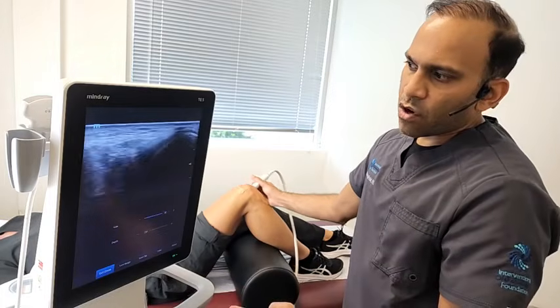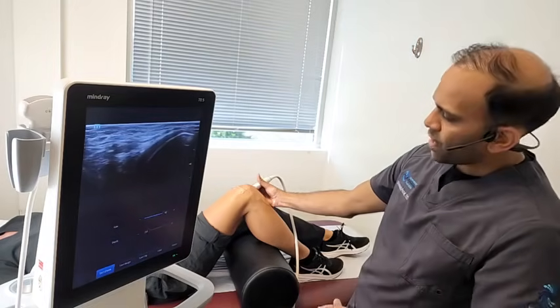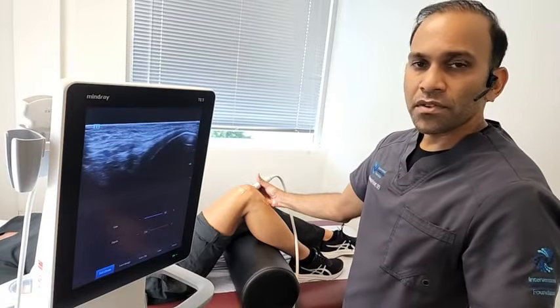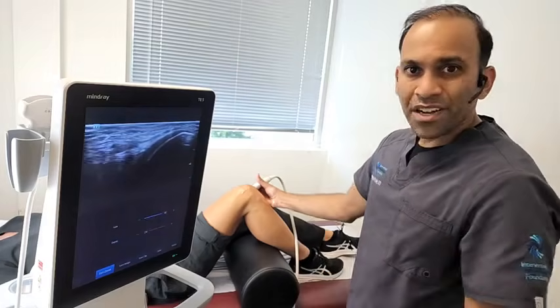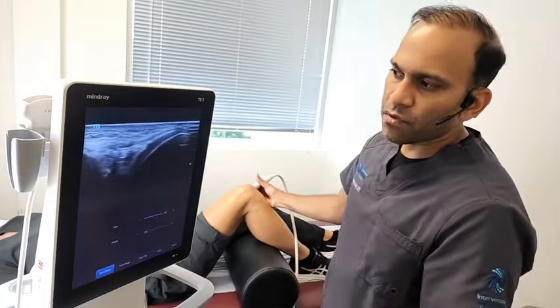And I go all the way down to the bottom of the femur, and you can see the way that I'm angled with my probe over here. I'm looking actually at the weight-bearing surface of the femur, or where that femur comes and attaches to the lower leg. Because her knee is bent, I can see that undersurface of the femur there. We get a beautiful view of the cartilage.